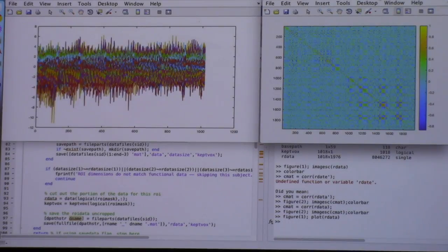So you lose the relative means to each voxel. Does that matter? You kind of have to remove the mean from each voxel, and once you've done that, your subsequent analysis is going to be taking two time points and correlating the patterns. Before you remove the mean, those two things were independent in time. But the mean is over time, which means that information from all time points is inserted into every time point. Does that make sense? So that's the same logic.